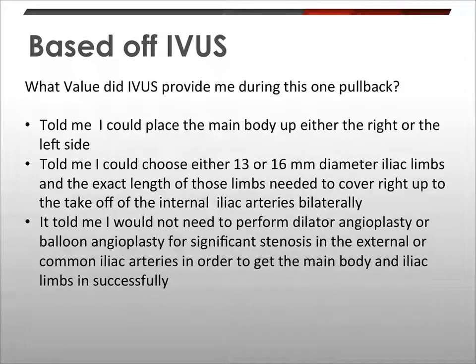In the next slide regarding the iliacs, it told me that I could place the main body up either the right or the left external iliac artery.